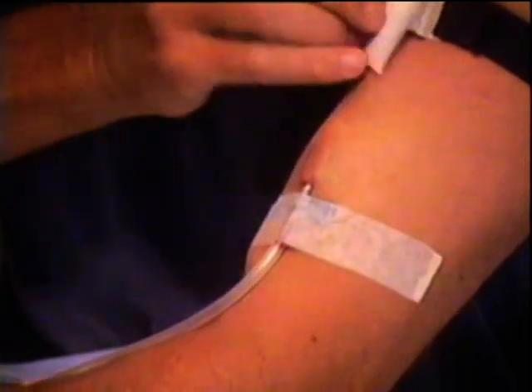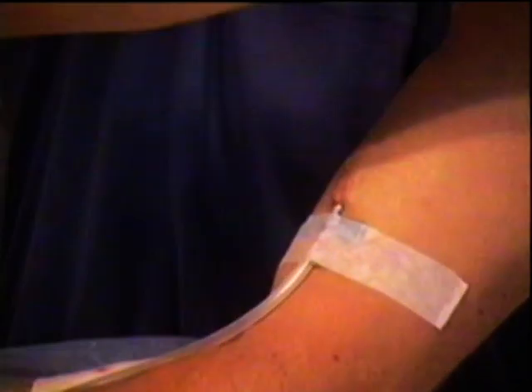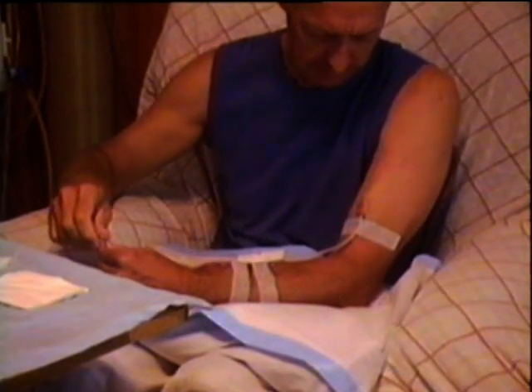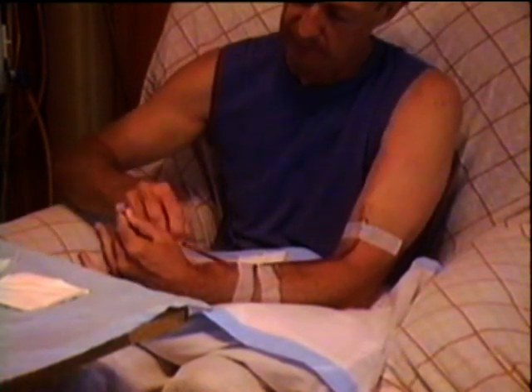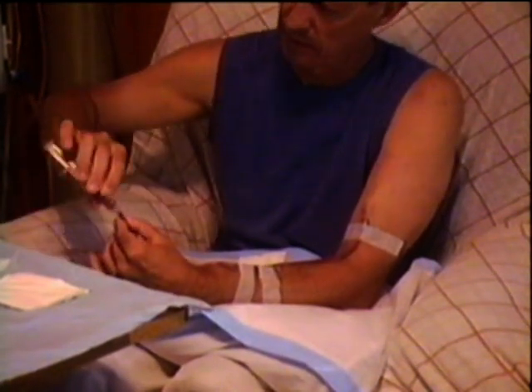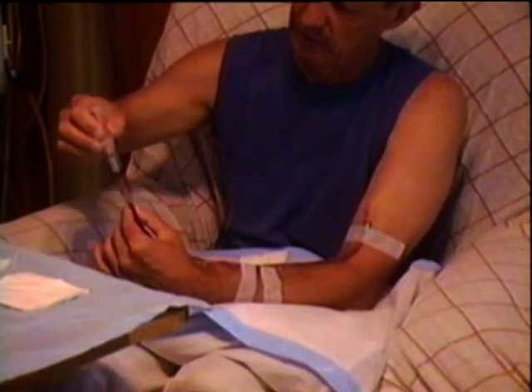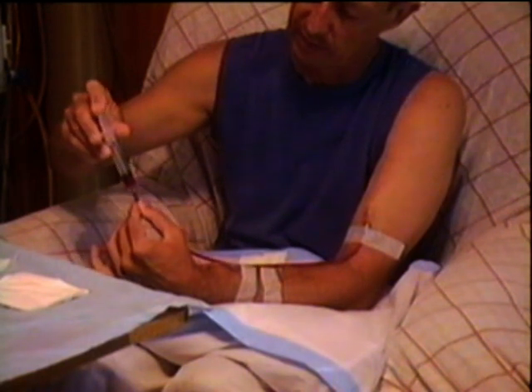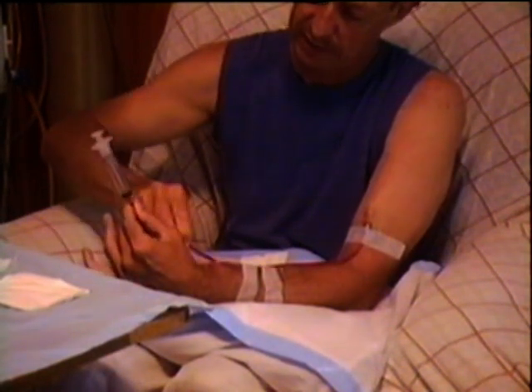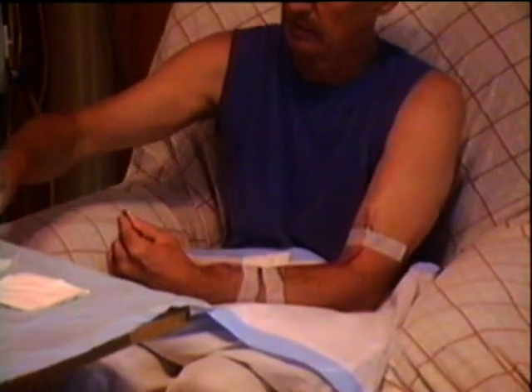Just tape that off. Now tape the tourniquet off, toss it over there. Now I've got to fill this up with blood, so I'll undo the cap — just undo it a little bit so the air gets in, and your heart will take over the rest. Clamp it up. Now I'll use the rest of this heparin and saline mix in here. Pull it back to get the air out, and pump that through, then toss that away.